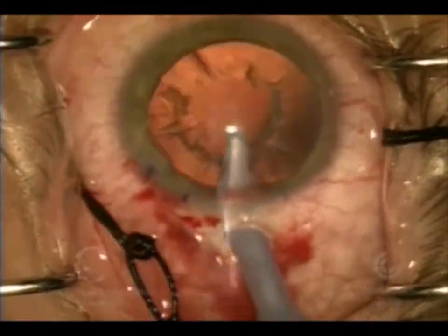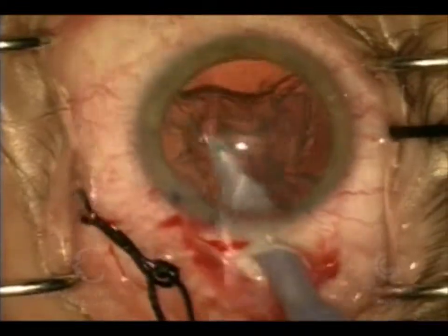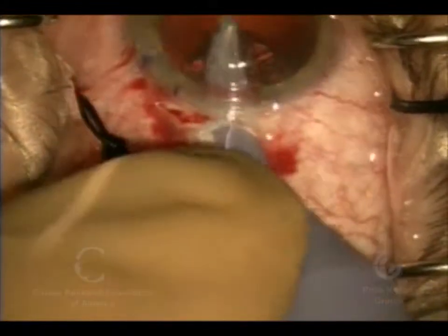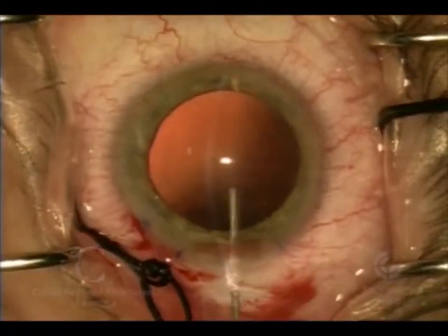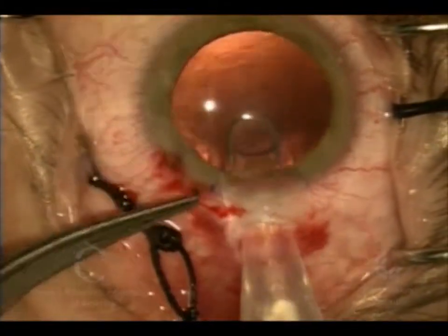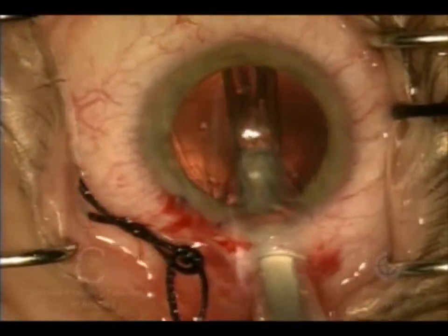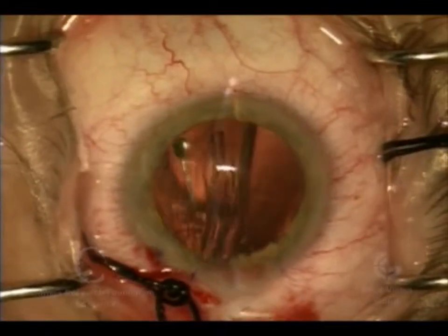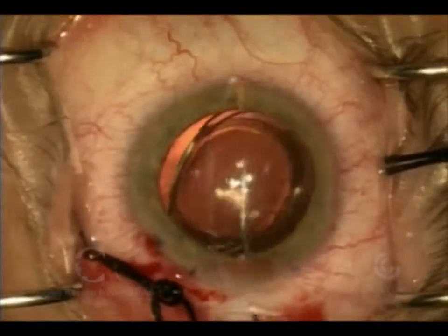Here we're using the ultrasound to remove the lens material. After that, we'll go in with a probe that is just irrigation and aspiration, and we'll use that to suck out the softer outer part of the cataract — the cortex. Once again we'll fill the eye with viscoelastic to maintain the shape, and we're going to inject a plastic lens into the membrane or bag that we left from the cataract. The plastic lens is much thinner than what the natural lens had been.